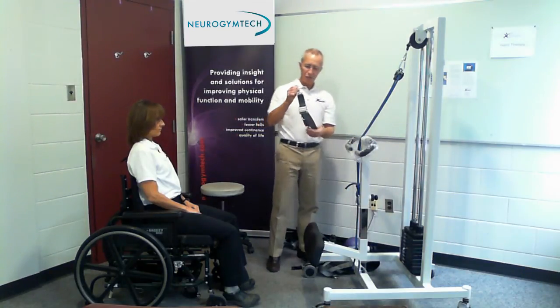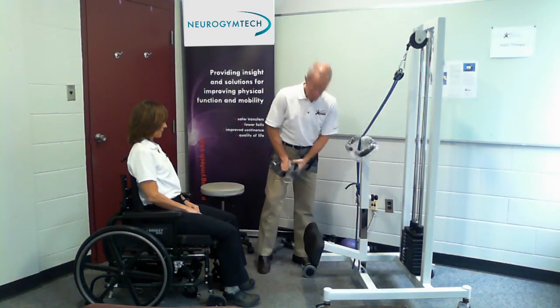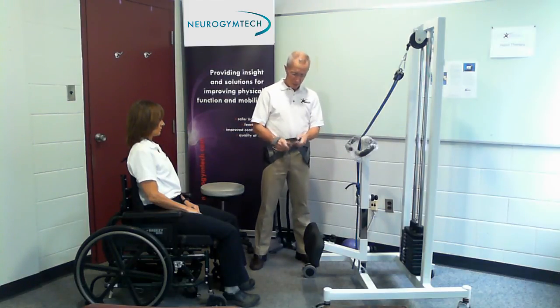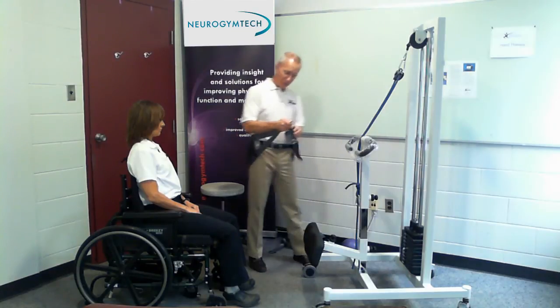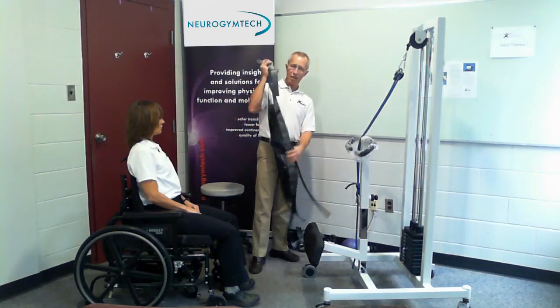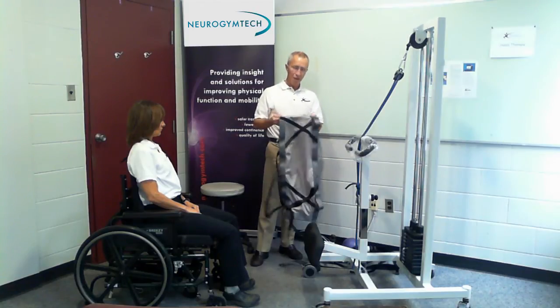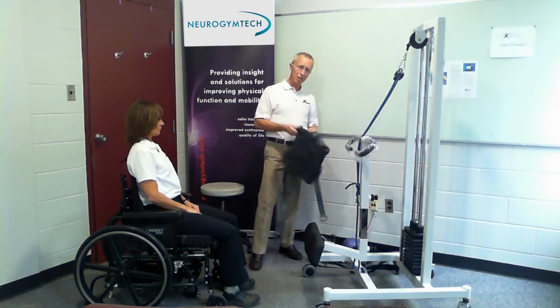The next piece is called a bariatric extender — all this does is give you a few more inches of girth. A lot of people ask about the weight restriction on the machine, but it's not a weight restriction — it's a girth restriction. If I can't put the rings together, I obviously can't train, but with this extender it buys you another 18 inches of girth. Typically that's around 300 pounds, because people's body types vary around the middle. And this is the special bariatric sling. We've had people over 600 pounds in this machine — because again, we're not lifting them. It's not a weight limitation, it's a girth limitation.